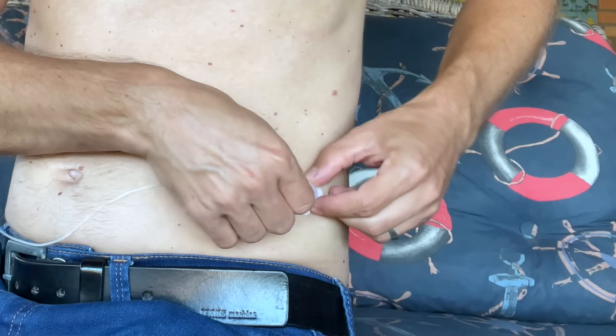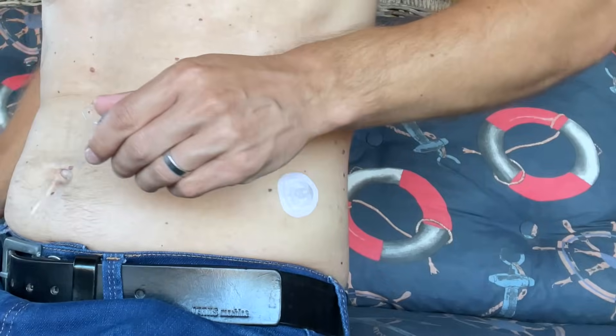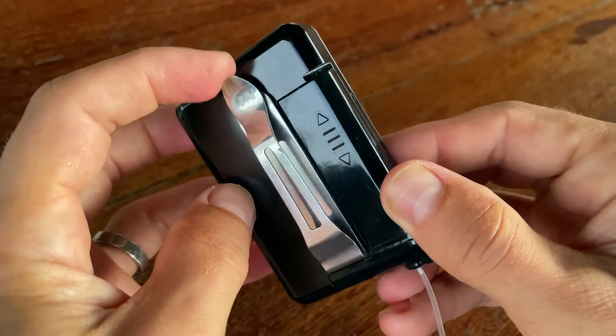I didn't like that case anyway because it was a bit too bulky, and when I wanted to take the pump out I had to disconnect the infusion set from my body — too complicated. I don't really want a case, I just needed a belt clip. So I got a cheap metal clip from Amazon which works really well and I'll put a link to it below.